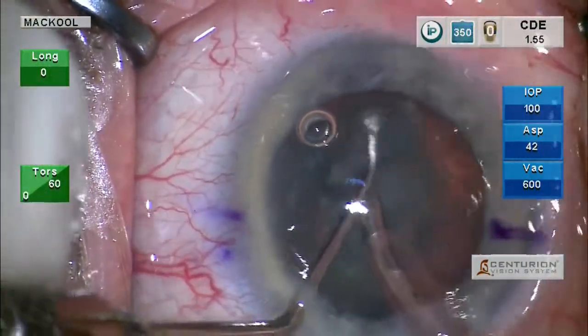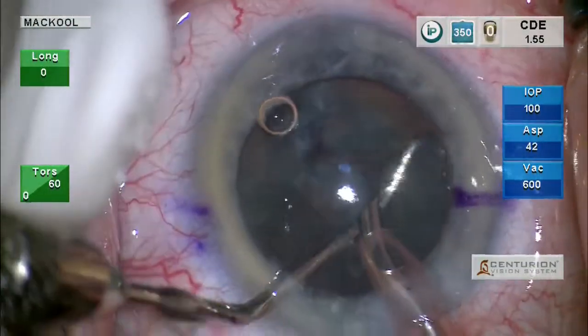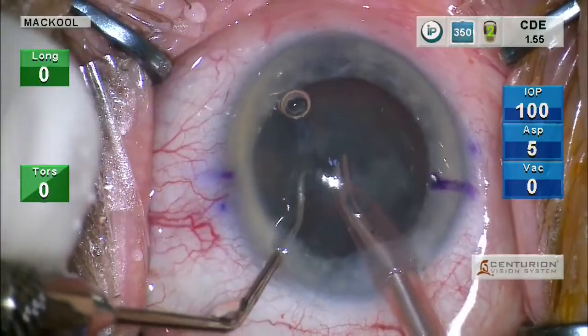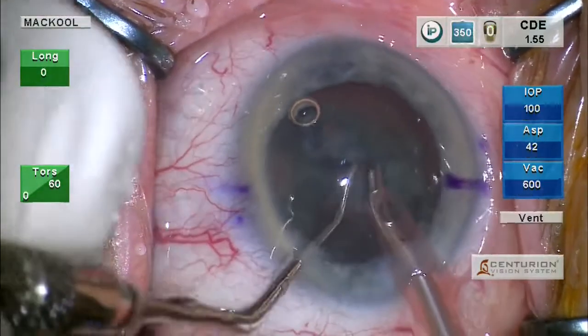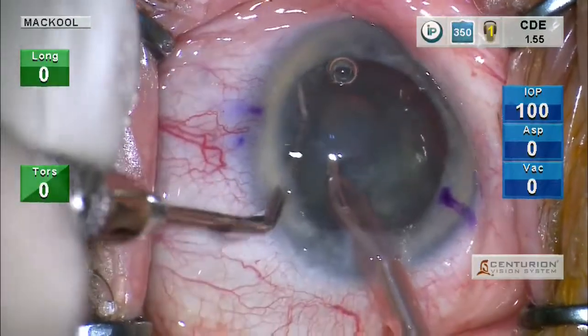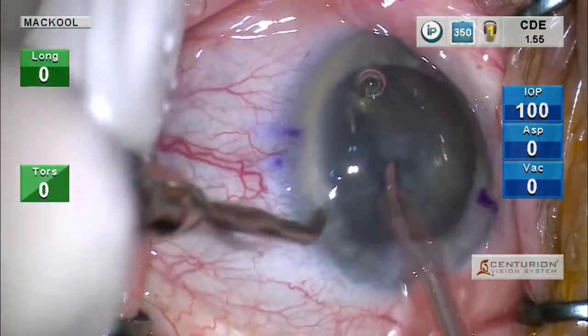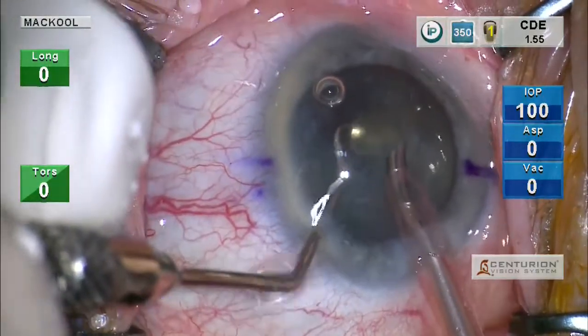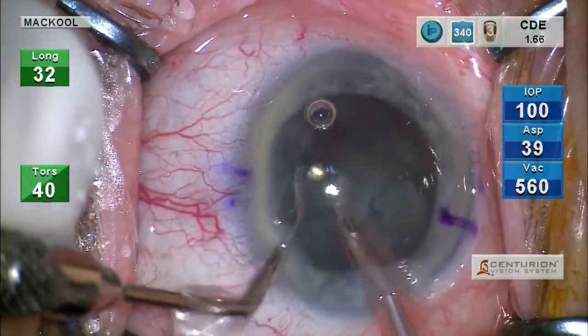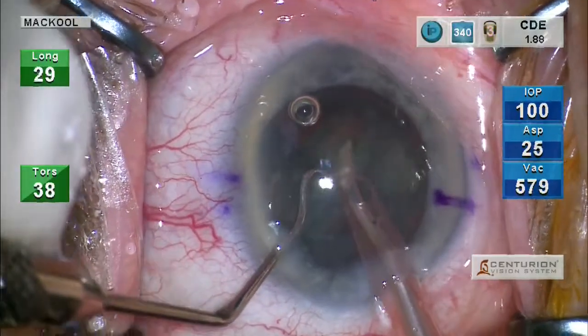Trimming that down a little bit, and then we'll rotate it over. And let's see if we can now chop this one remaining segment. And if I can't, because it's kind of loose, I'm going to turn it sideways and just remove it in situ.